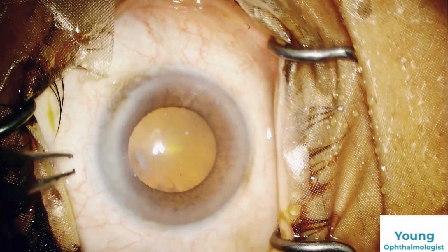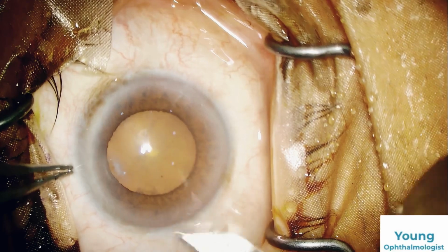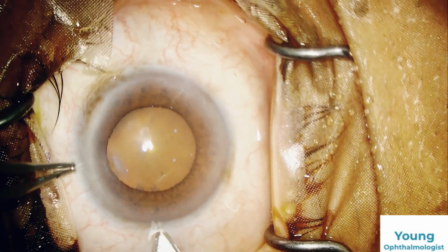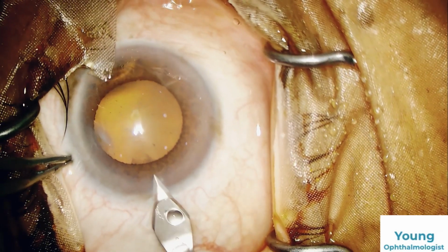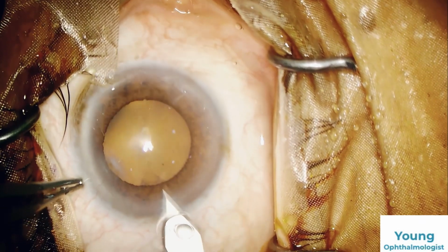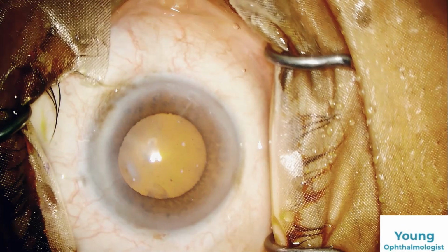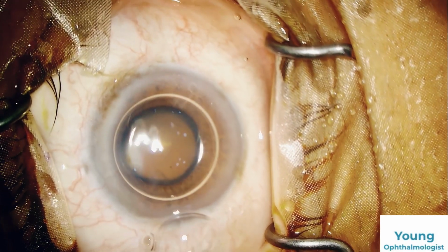Now we will be making a posterior limbal incision 2.8 mm in width. Try to make a tunnel length of at least 1.5 mm to avoid any iris prolapse and to maintain the chamber intraoperatively. It's a 3 planar incision, as you can see. The entry was done. Pushing air bubble inside the eye.